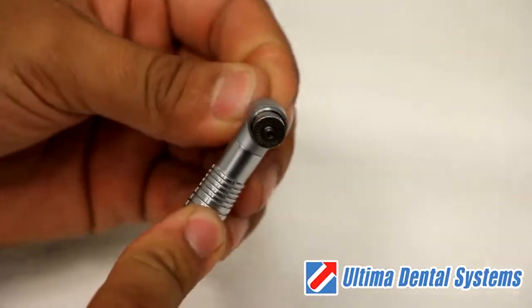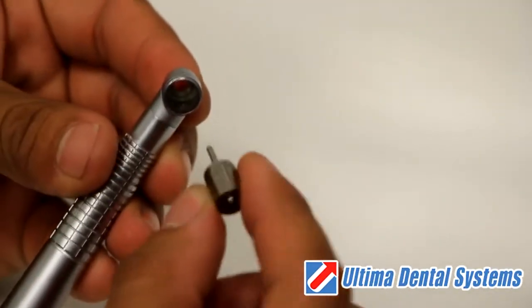Push up on the seated burr or blank and remove the old turbine from the handpiece.